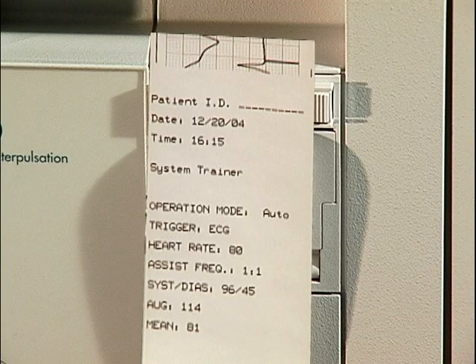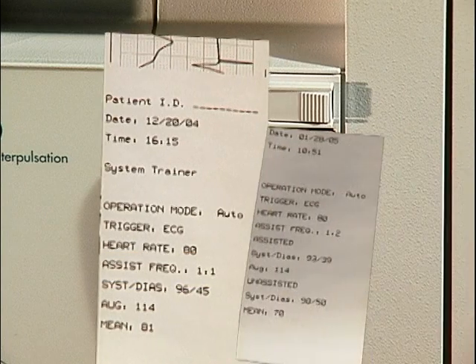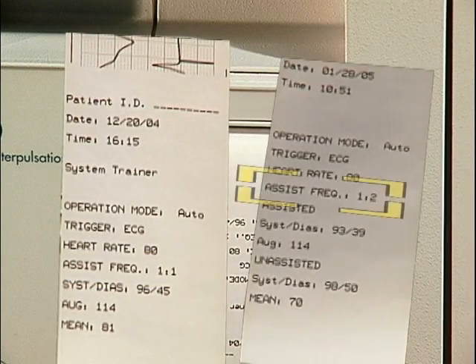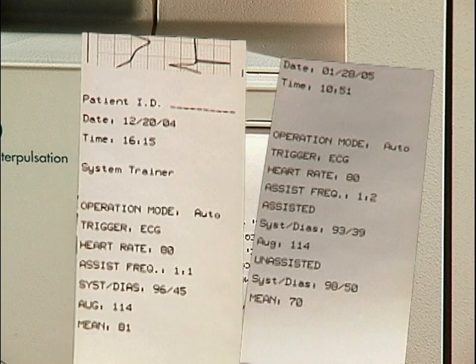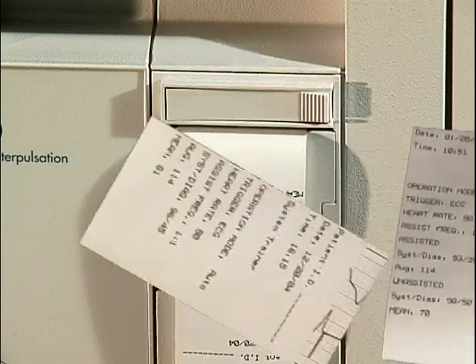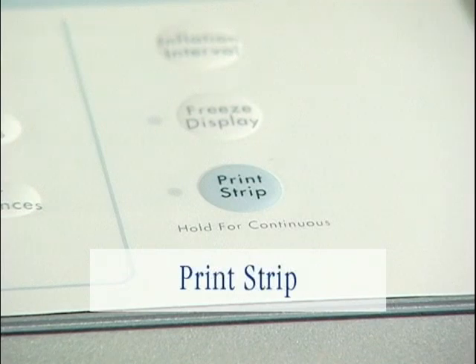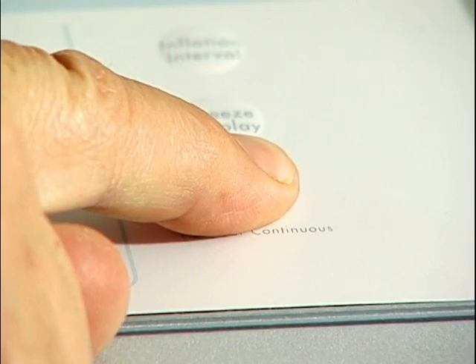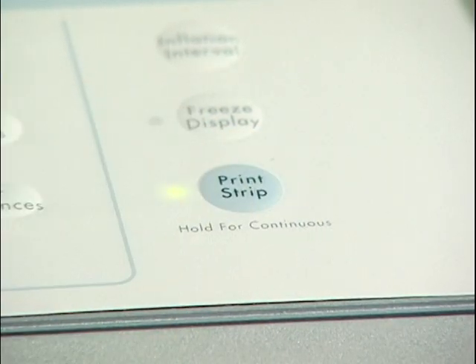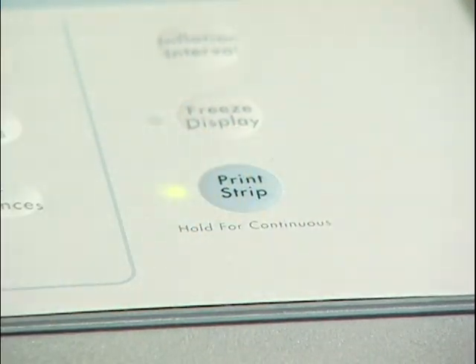The format of the annotation depends upon the IAB assist frequency selection. When 1 to 2 or 1 to 3 is selected as the IAB frequency, the recorder will print both assisted and unassisted systolic and diastolic pressure information. To create a static printout, press the Print Strip key here. To create a continuous printout, hold the Print Strip key for 2 seconds. The associated LED will blink as printing continues. To stop a continuous printout, press the Print Strip key again.